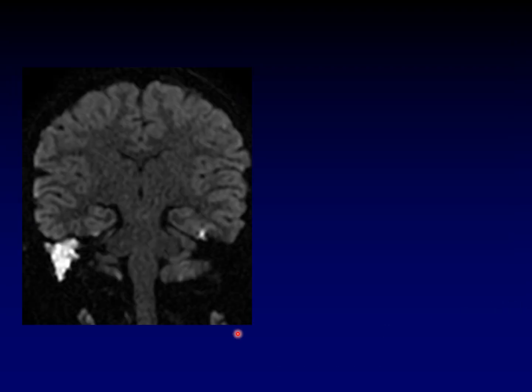This is what recurrent cholesteatoma looks like in a different patient. It is much brighter than the brain. So don't settle for it being similar to the brain — that does not mean it's a recurrent cholesteatoma. It should be brighter than brain, not just brighter than the surrounding temporal bone — brighter than gray matter on a diffusion-weighted image. That's a recurrent cholesteatoma.